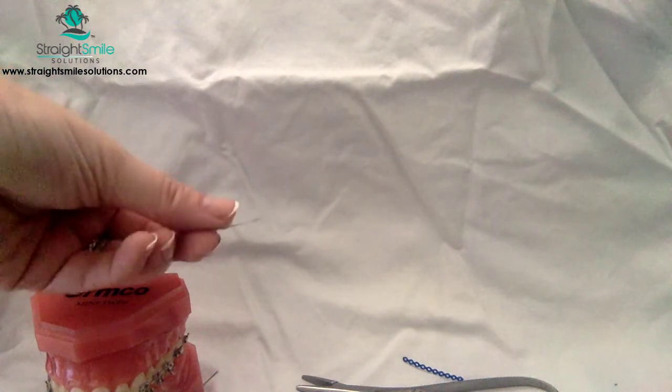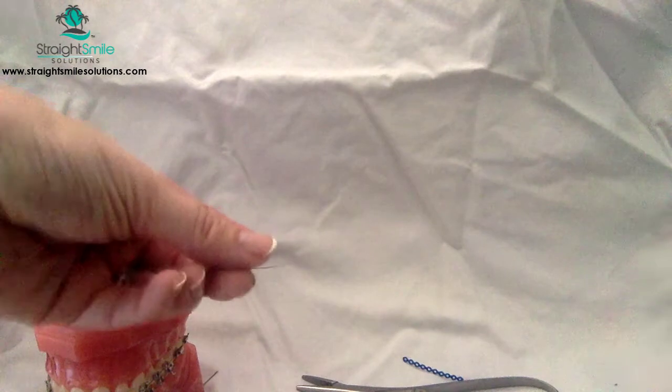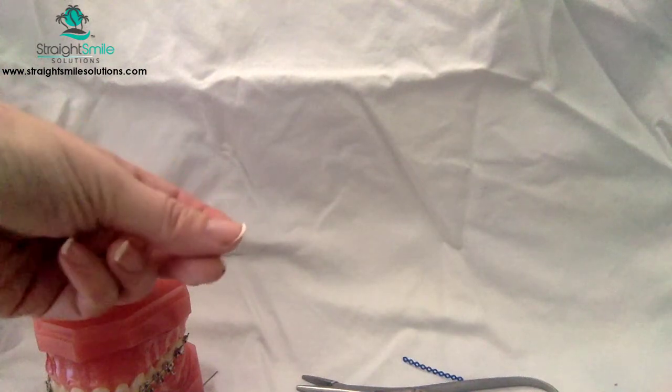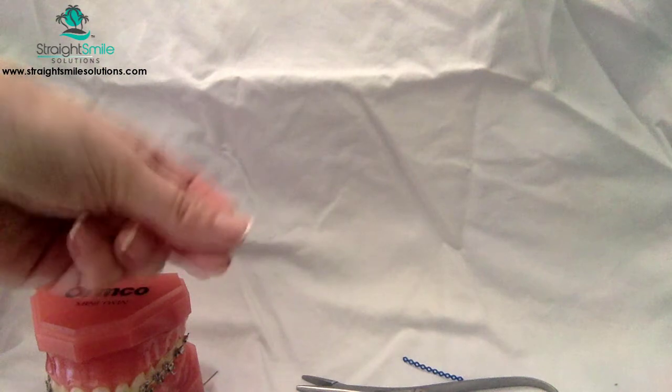If there's too much excess and you haven't cinched that area, then you can do it all over again. Cinch it a little bit more towards the mesial. If you're too short, then you're going to have to do it all over again. Remember, each wire is about $1, so don't waste them. So that's how you cinch.